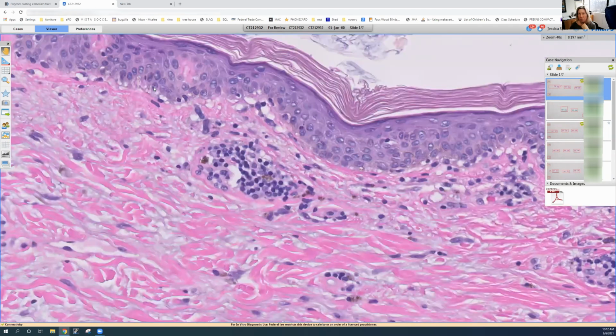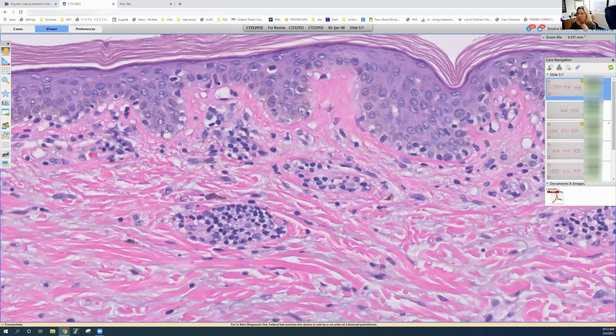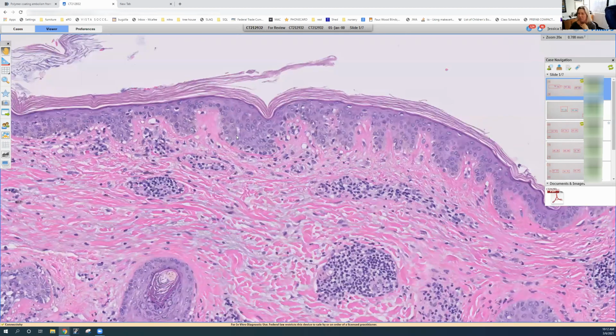There's a little bit of vacuolar change, maybe a necrotic keratinocyte, some lymphocytes. They're these dark blue cells with not much cytoplasm, or vacuolar change. Very subtle, really, though. And then we have this kind of smudgy pink basement membrane here. We also see these don't look like normal basal cells. They're kind of large, and so we call this a squamotized basal layer because they look more like the squamous cells of the epidermis rather than the smaller blue basaloid layer.